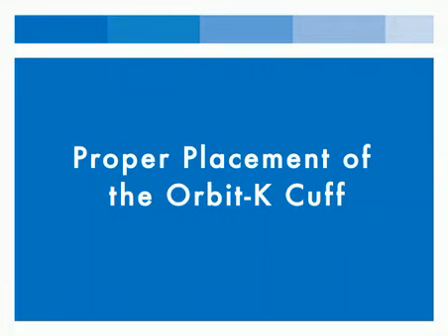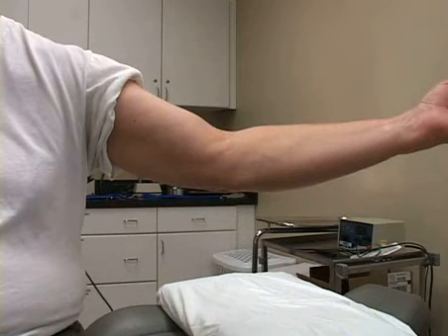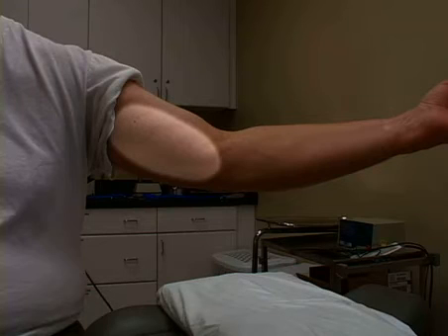Proper placement of the cuff is imperative to taking accurate blood pressure measurements. To ensure the proper placement of the cuff, first locate the brachial artery between the bicep and tricep.